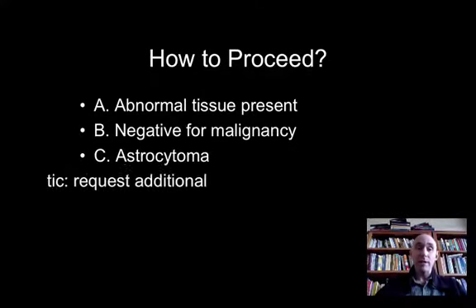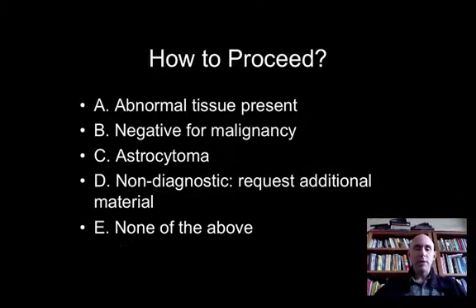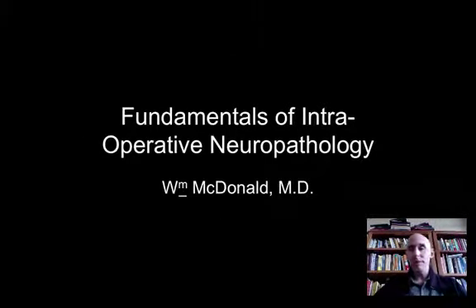Do you call it astrocytoma? Do you say, nope, I'm going to dig my heels in, this is non-diagnostic, get me some more material? Or do you do something else altogether? Well, this presentation is intended to answer that kind of question.